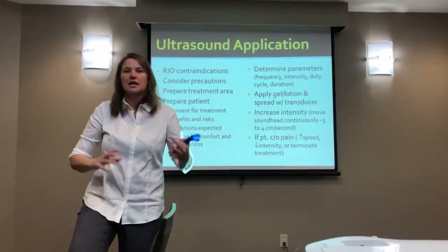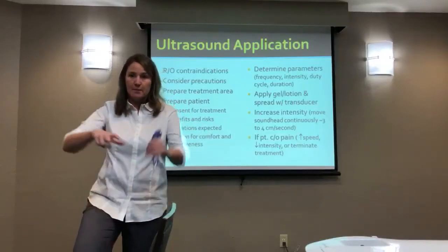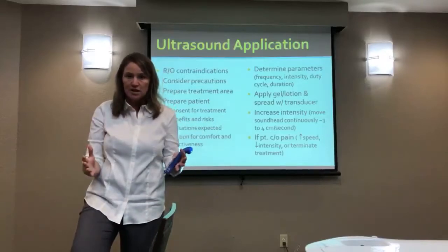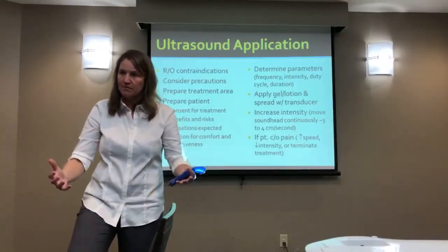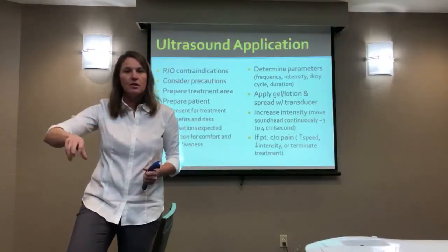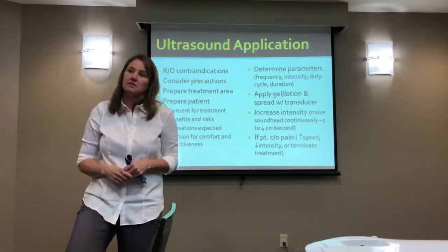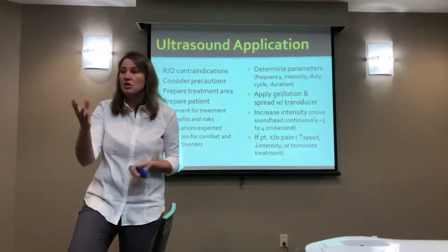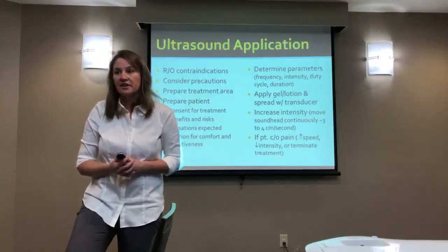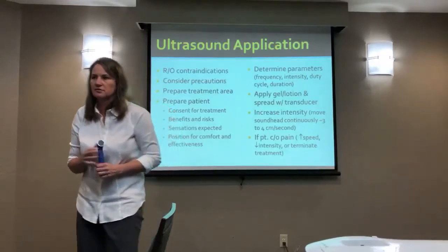So if I'm taking it in a room or using it on somebody who's very vulnerable, I may put a bag over the device. They also make a little screen protector that you put over top of any kind of mechanical device that you're using, and you touch the buttons or turn through the bag, and that way you're not actually touching it and exposing it. So there are all different methods depending on your setting and your level of infection control. I don't know if that answered the question, did it? Or did I dance around it?